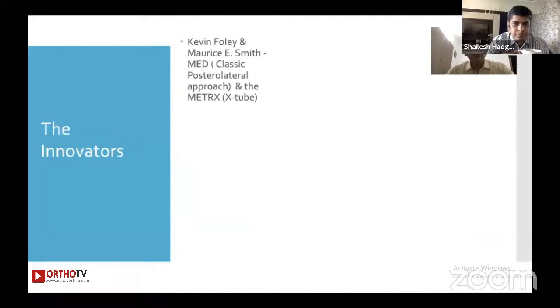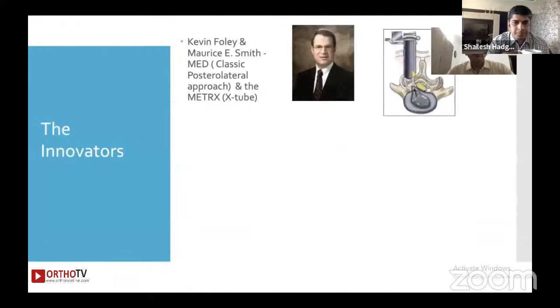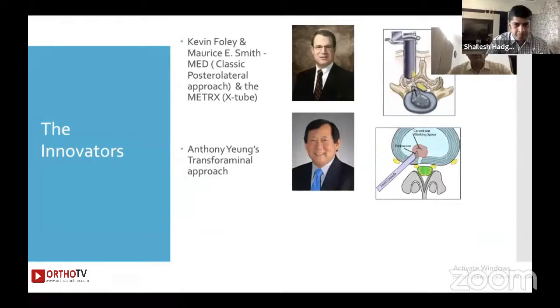So if we take a quick look at Kevin Foley, he along with Maurice Smith developed the classic posterolateral approach and the METRx tube, which subsequently had a very significant amount of applications across the lumbar spine. Anthony Yeung developed the transforaminal approach, which was basically a modification of Kambin's approach, and he has popularized this quite well using the 7 mm cannula.